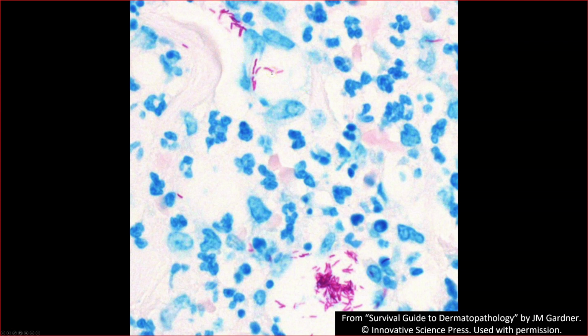I feel like a lot of times the atypical mycobacteria depends on the species. You can't tell for sure what species, of course, on the Fite stain. But I feel like atypical mycobacteria tend to be a little longer than what you'd see in TB or leprosy. But again, I'm probably not nearly as expert on that as other people are.